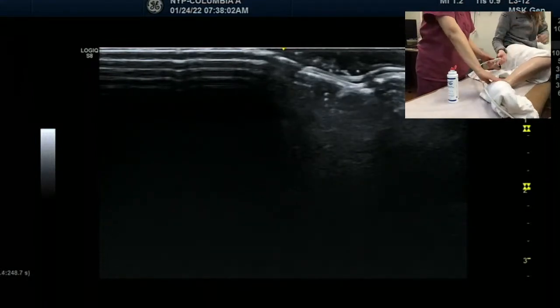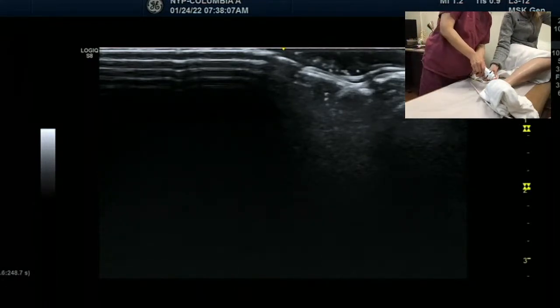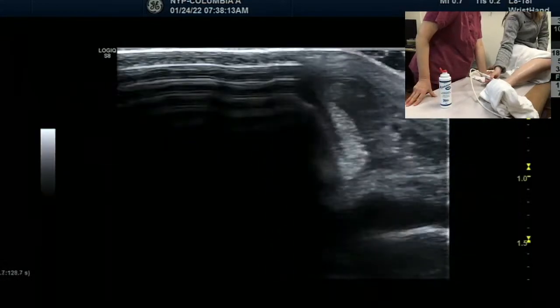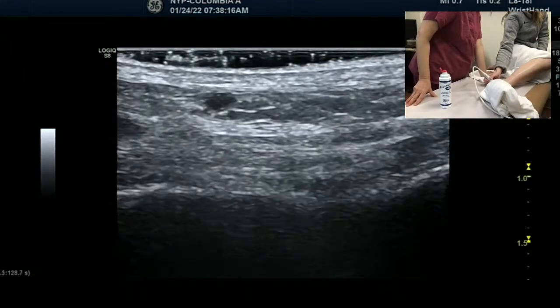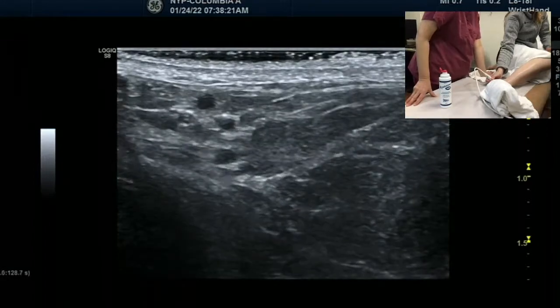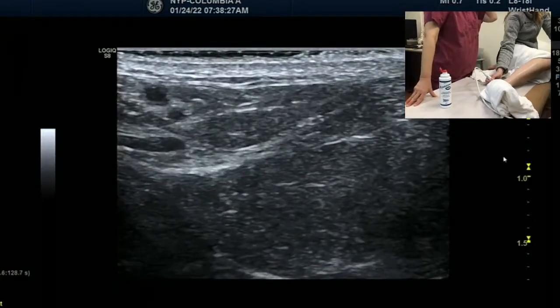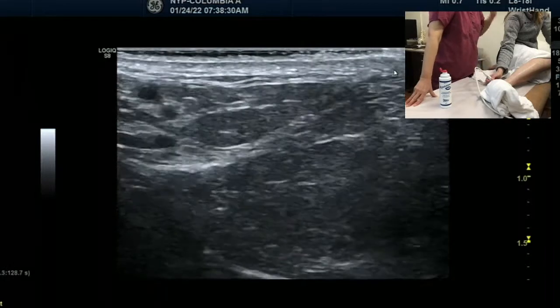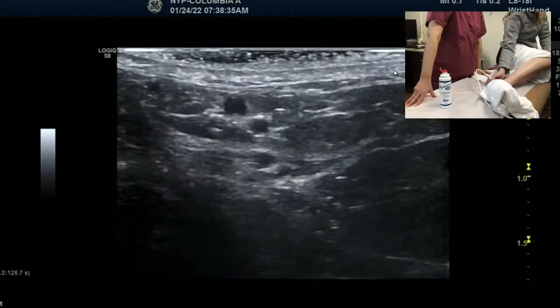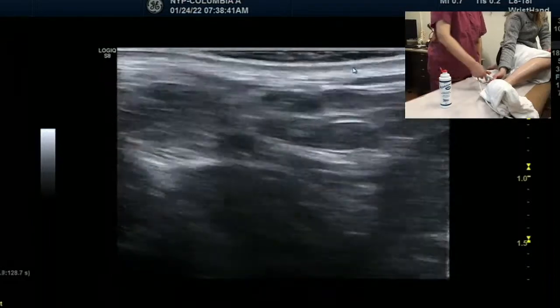Okay. So we have to use the elevator technique. That's why I put a lot of gel here. We may need a little more. Change the probe. So go up a little more. So I see it already. Yeah, so you can see the hammock. As I go this way, you can see that fibrillar pattern again starting for the Achilles tendon. And as we come this way, we can see a little bit of the lateral.